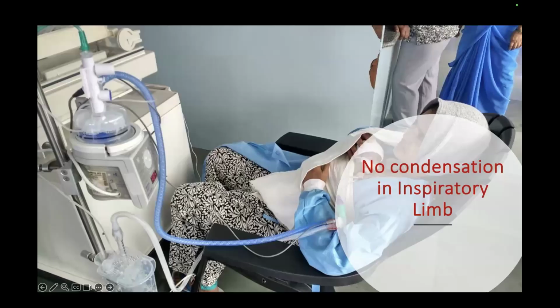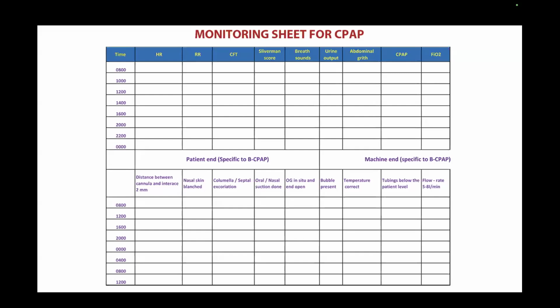Always add kangaroo mother care, or skin to skin contact, with bubble CPAP, especially once the baby is stable. It will definitely improve the overall care of the babies, and the outcome, especially the neurological outcome, is going to be better when you mix skin to skin or kangaroo care with bubble CPAP.